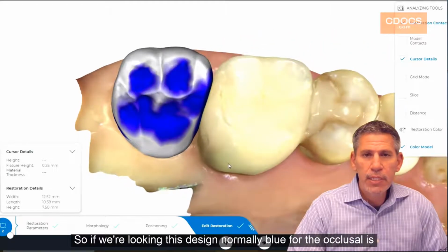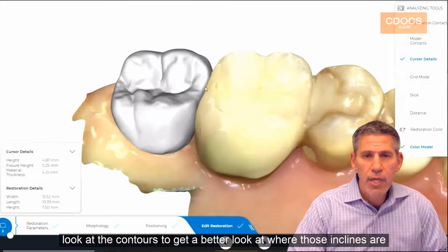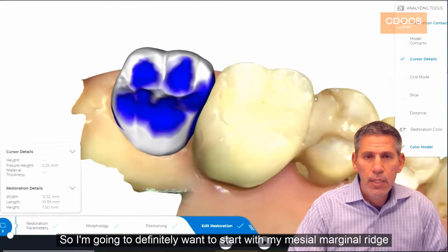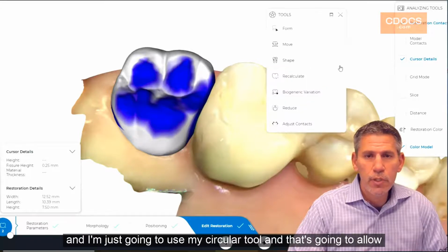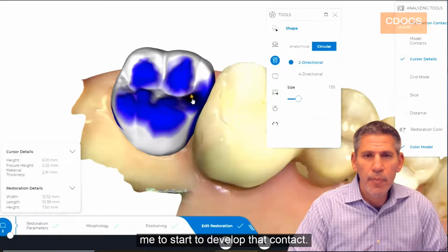So if we're looking at this design, normally blue for the occlusal is fine, but here I want to first take a look. I'm going to take off the colors, look at the contours, get a better look at where those inclines are, and now we're going to build our occlusion with purpose. I'm definitely going to want to start with my mesial marginal ridge, and I'm just going to use my circular tool, and that's going to allow me to start to develop that contact.